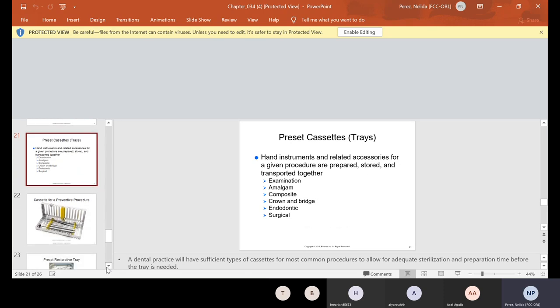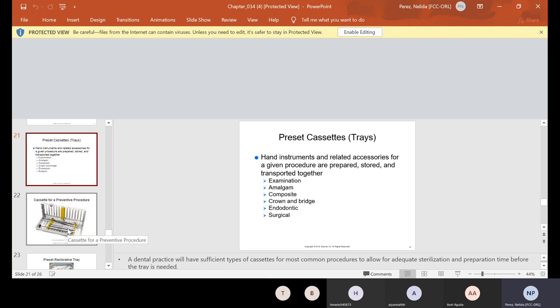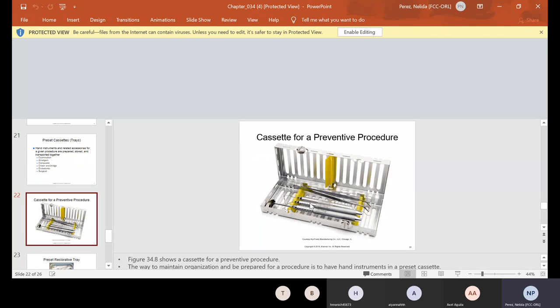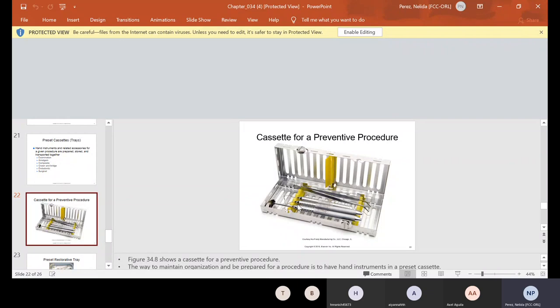Now, instruments can be put in what's called a preset tray, cassettes or trays, whatever you want to call it. Hand instruments and related accessories for a given procedure are prepared, stored and transported together. So if you have a procedure, sometimes just examination cassettes, we have those separately. Sometimes we just have one for amalgam, one for composite, one for crown and bridge, one for root canal and one for surgical. So in this case, if you notice, this will be a small cassette and this cassette only holds the basic again, mouth mirror, explorer, cotton plier. And in this one, the periodontal probe is in there too. So sometimes that's included with oral examinations, your first time examinations, because the doctor needs to check the gums. And we use the periodontal probe for that.